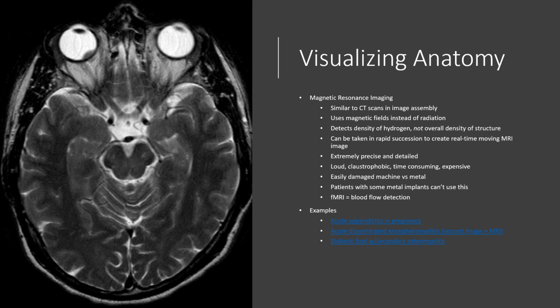This is extremely precise. This is extremely detailed. Unfortunately, getting an MRI, for those of you who haven't had one done, it is a loud experience. It's claustrophobic. It takes a long time to even do a simple MRI. It's extremely expensive to do, both for the patient and for the hospital. These are all pretty big cons, some more so than others.